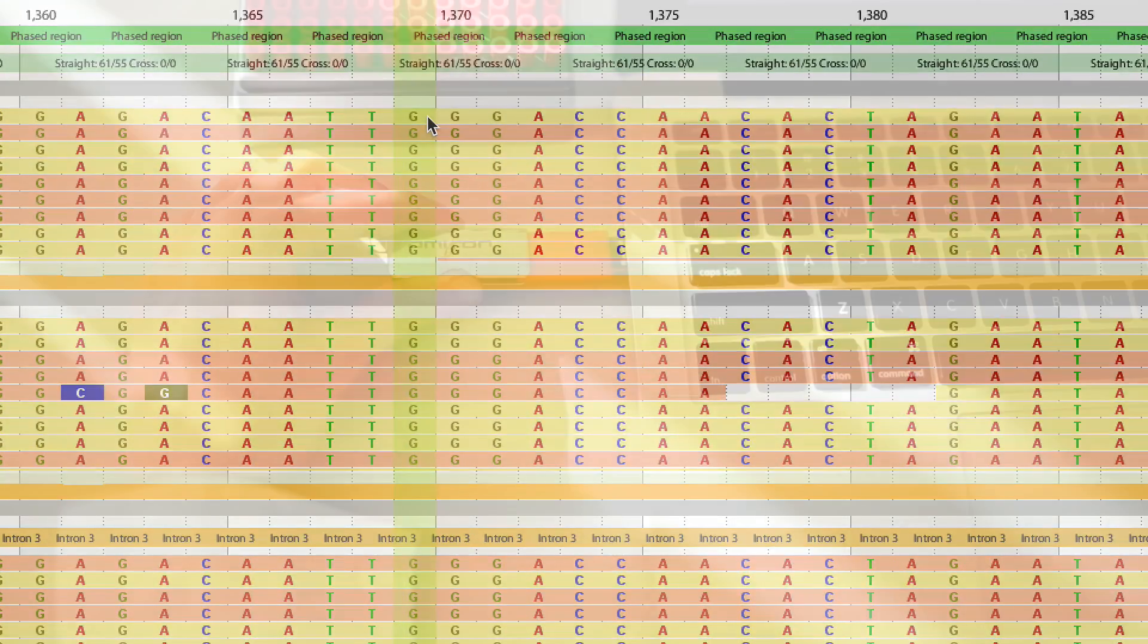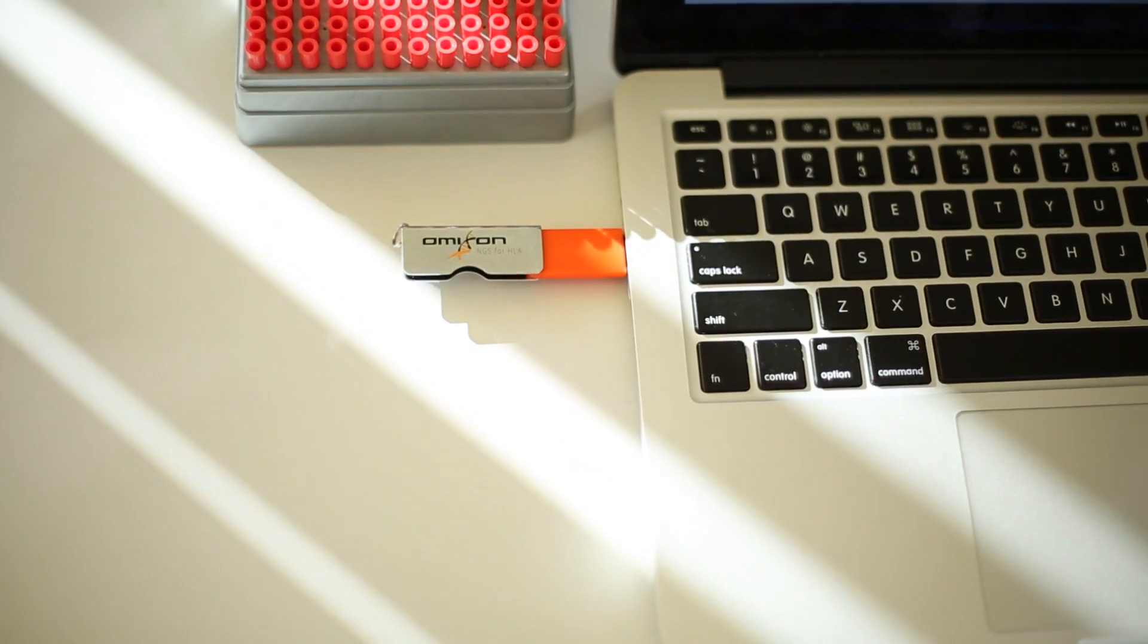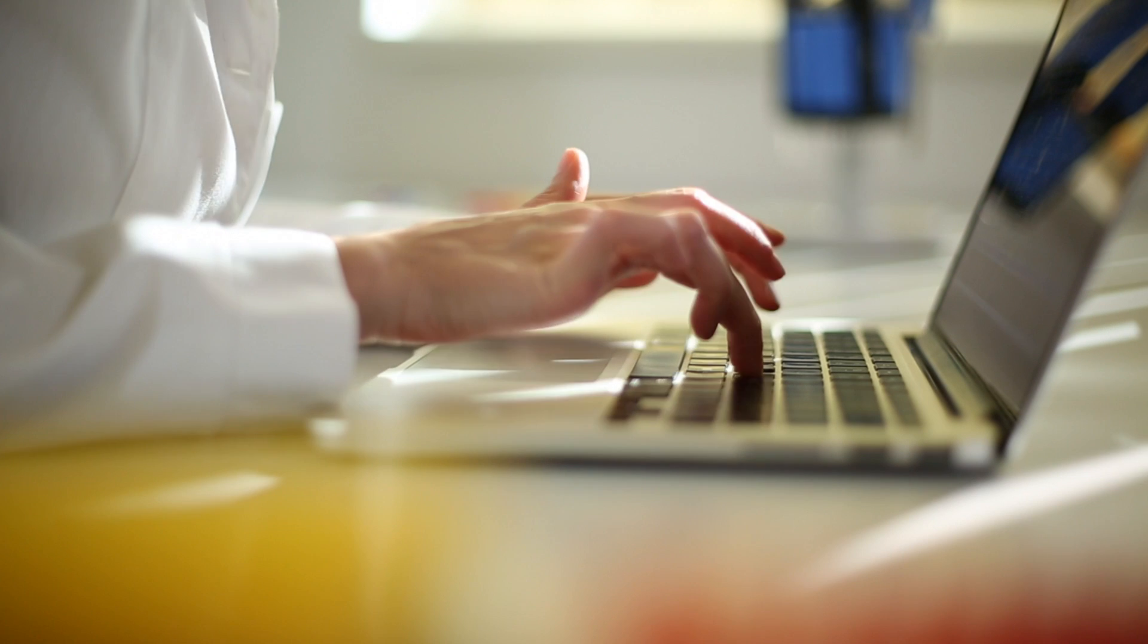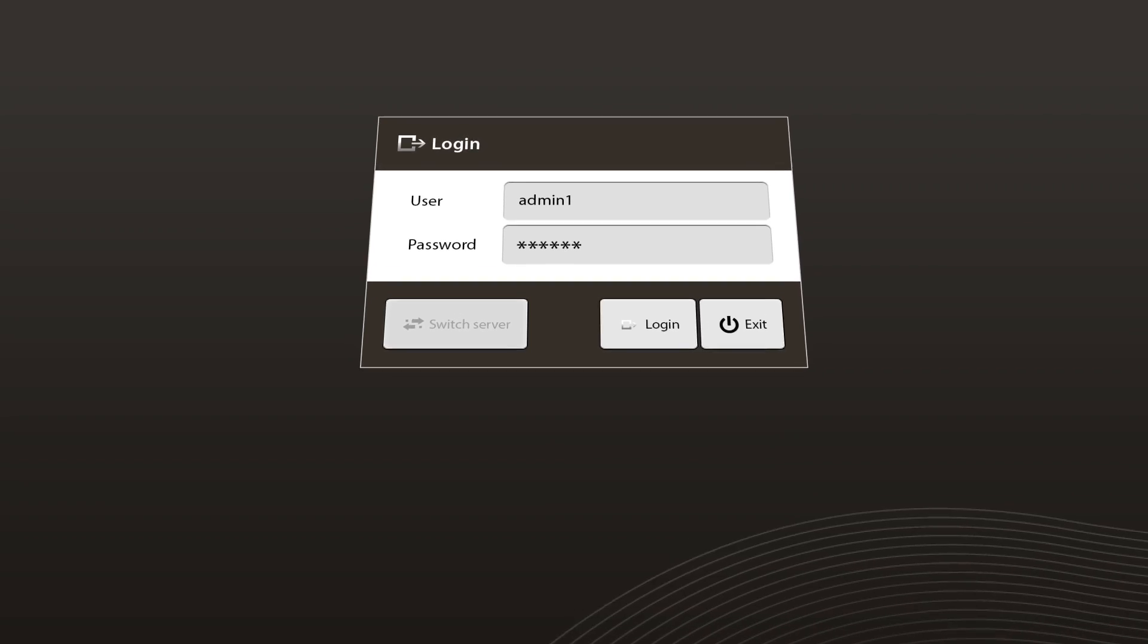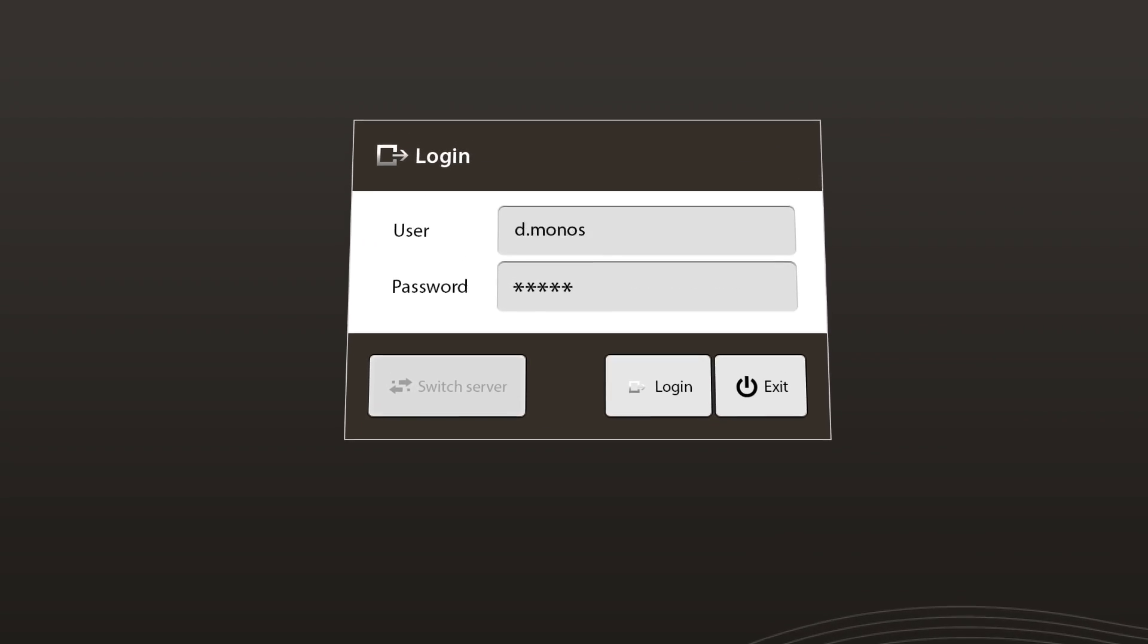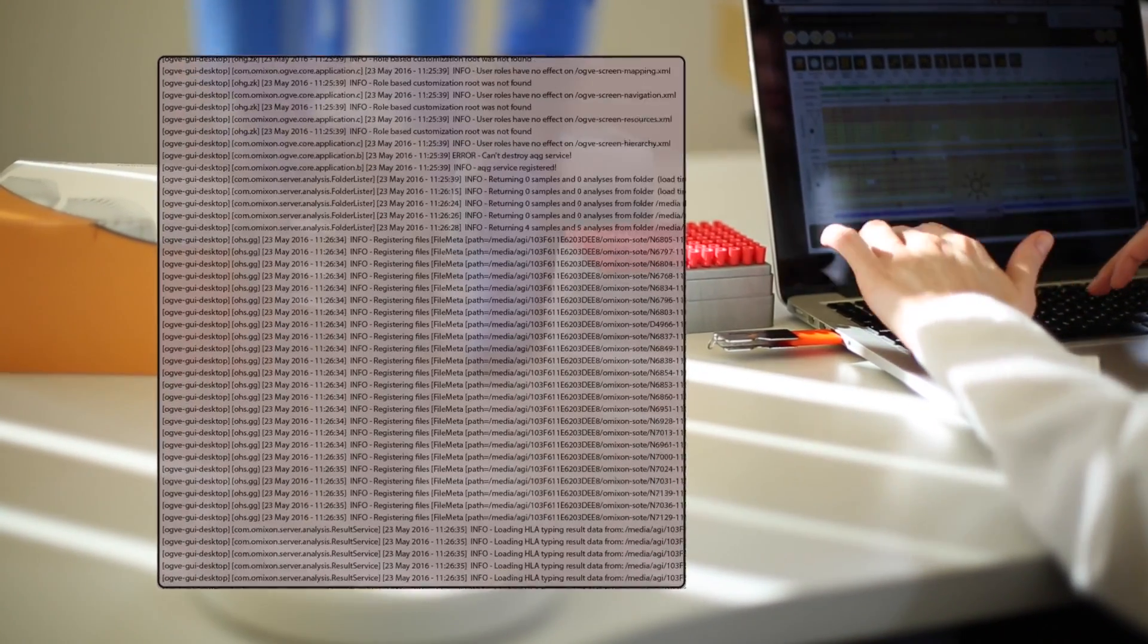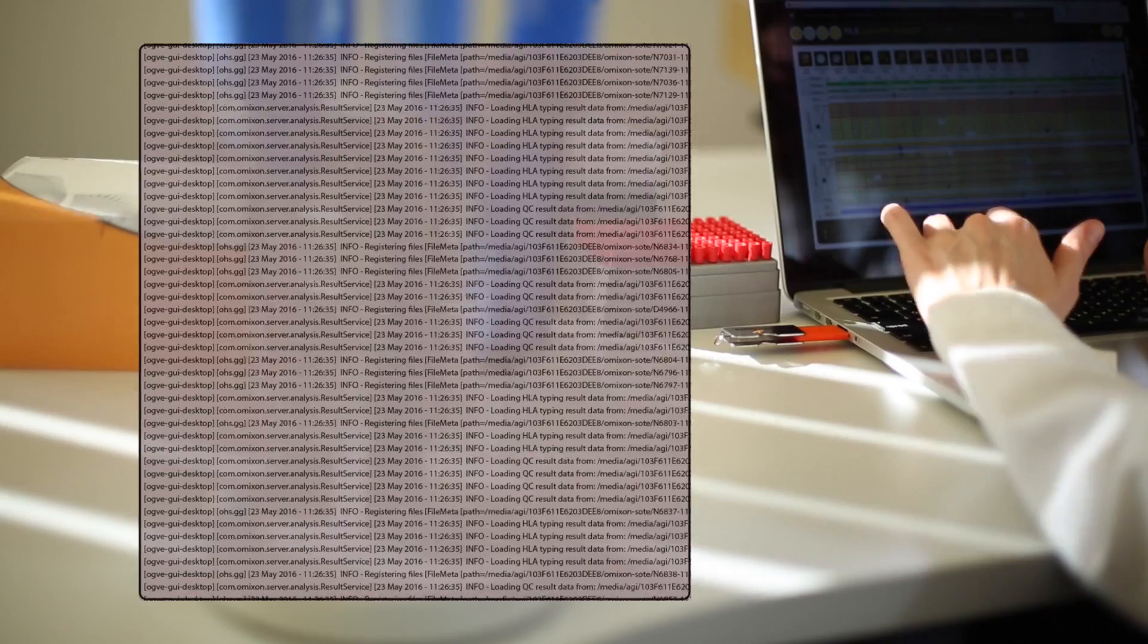To support laboratory SOPs for reviewing and accepting results, each user has their own account with different roles assigned to technicians and reviewers. All actions are tracked with a full audit trail to comply with all necessary regulatory requirements.